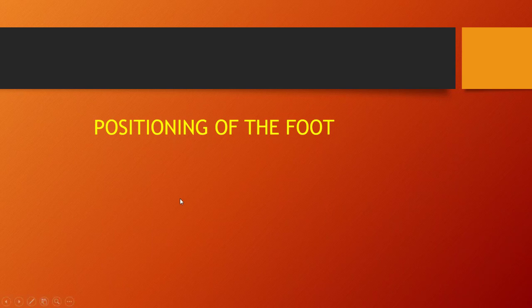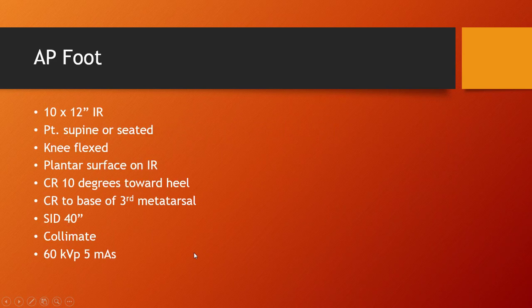Hi, and welcome to chapter 6. We're going to continue on with positioning of the foot. Let's talk about the AP foot.